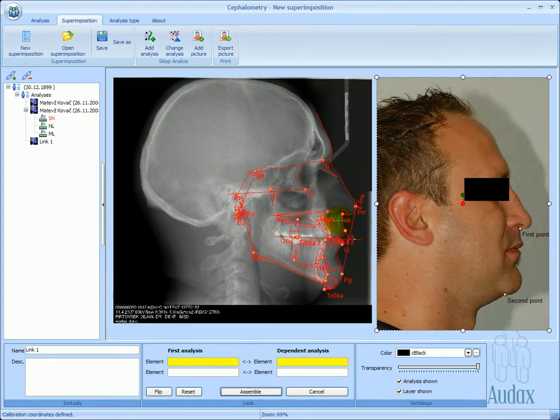By adjusting the image transparency, the correct alignment can be easily checked.